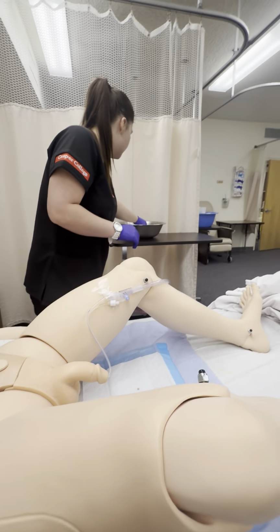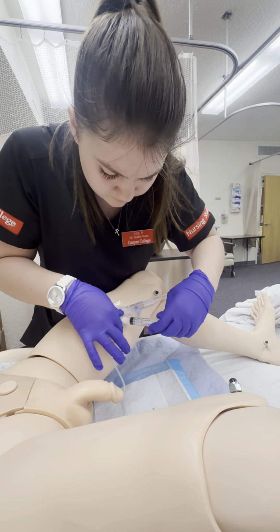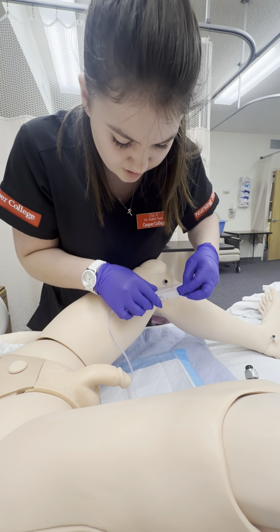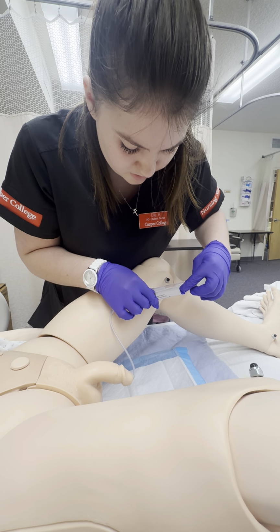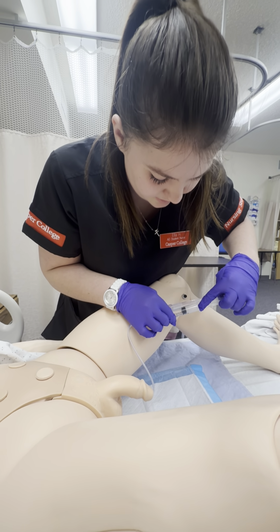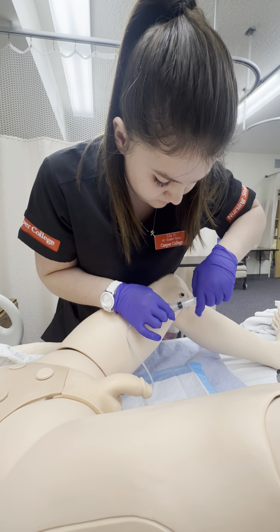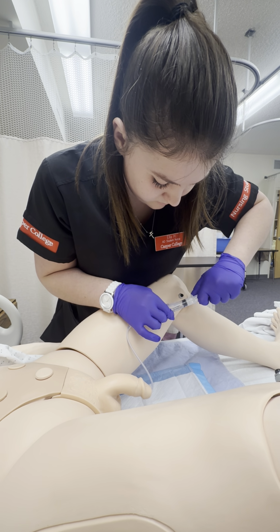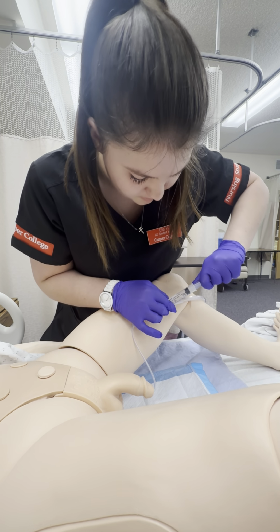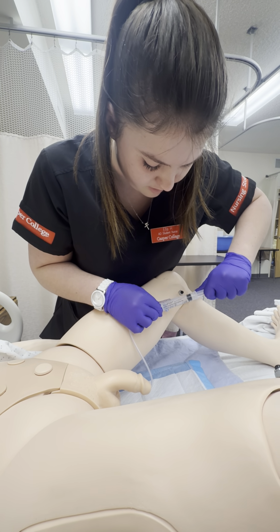I'm going to go ahead and take my syringe here. We're going to deflate this balloon. And we did put 10 mLs in, so we're going to get right around that same amount out to make sure that it is fully deflated. Okay. Looks like we've got just under 10 mLs out, but it looks like we've got all of it out, so.